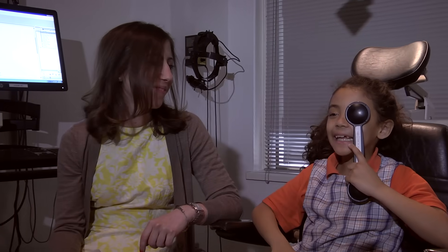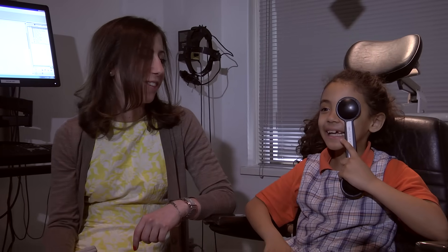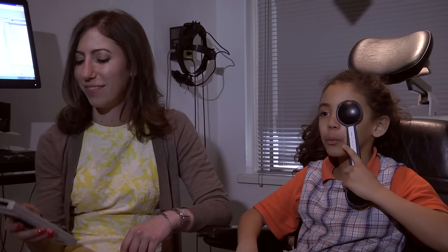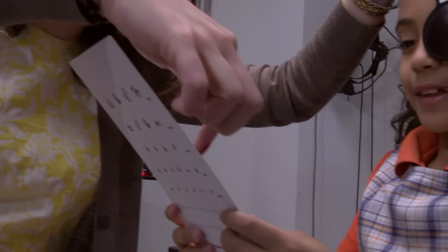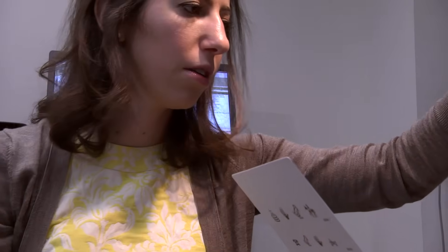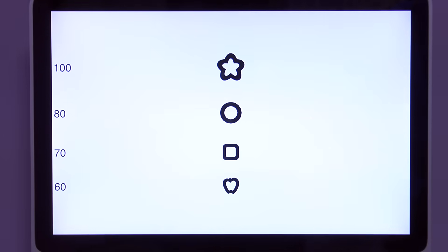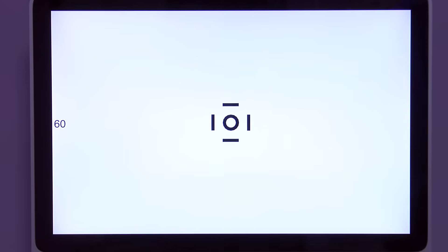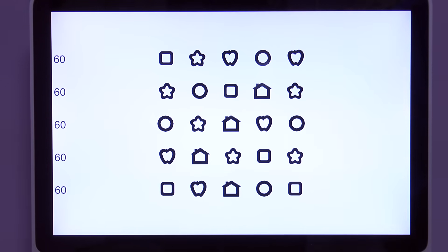After we get a thorough history, we're going to check the child's vision. We typically check the eyes one at a time and then both eyes together. We like to check at distance and at near. For younger children who don't know their alphabet, we have different types of acuity systems that use pictures.